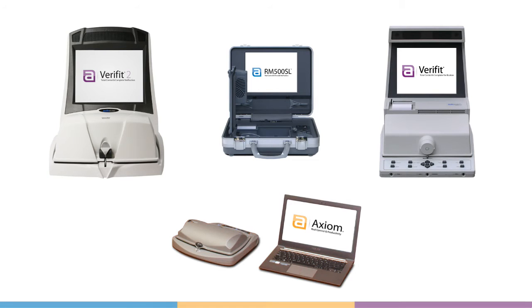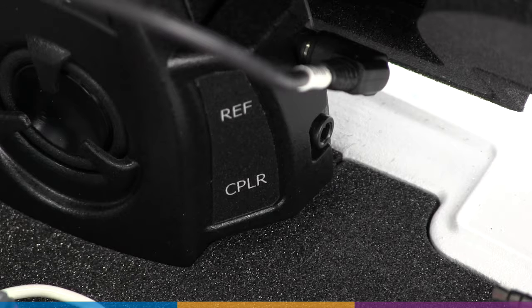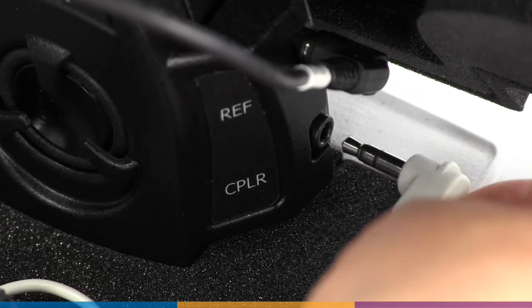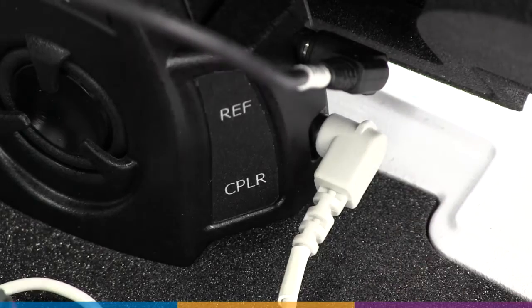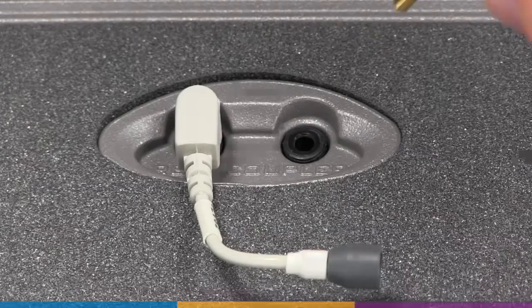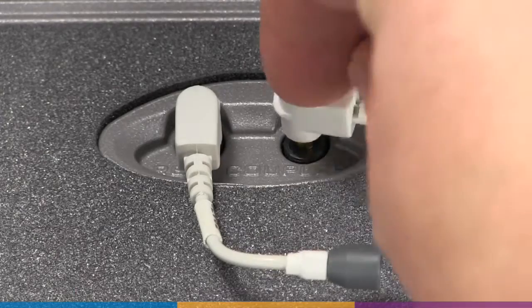This video will cover the TestBox microphone user calibration on AudioScan hearing instrument fitting systems. First, ensure both coupler and reference microphones are properly connected.